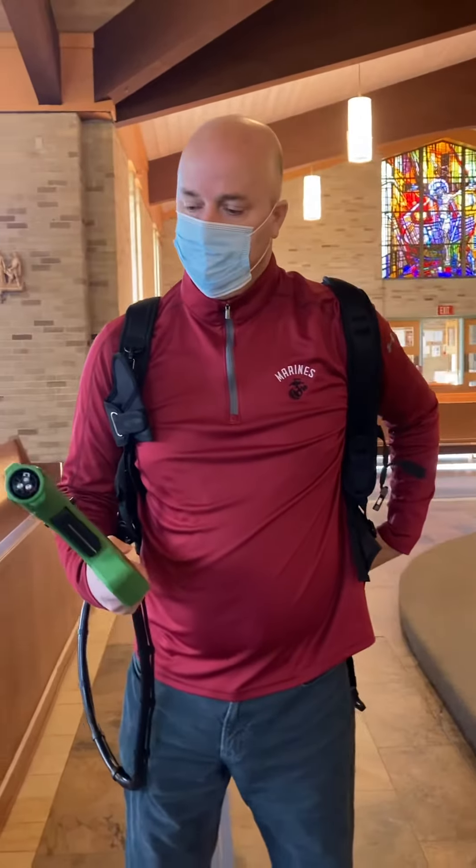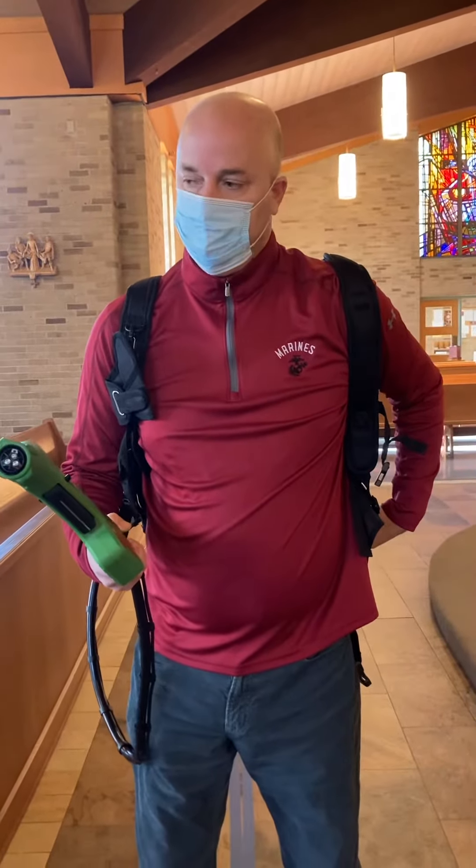This is Patrick Vogt. He's going to demonstrate for us the new electrostatic cleaning device.